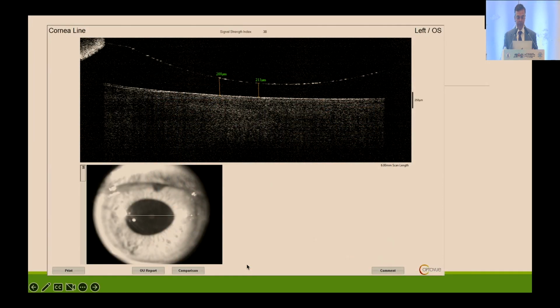But going on to more important, useful things, very rarely you will get an ICL which is upside down. This patient came to me having had ICL done somewhere in both eyes. Both eyes looked good, but one eye had poor vision, about 6/18. And that ICL looked a little funny to me, with the iris kind of being pushed forward in the periphery.